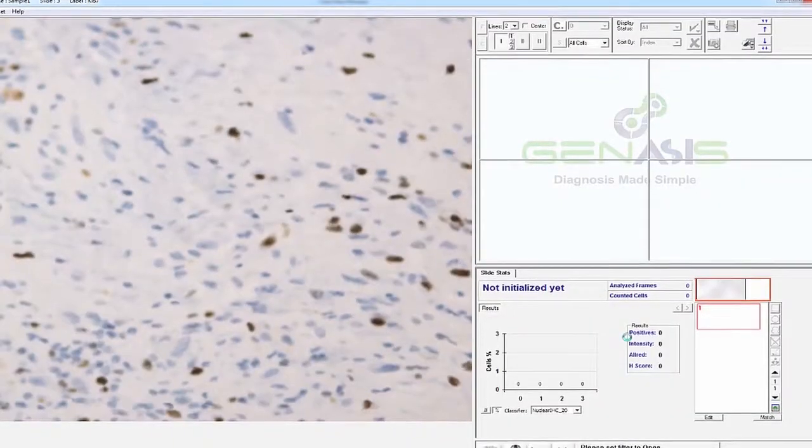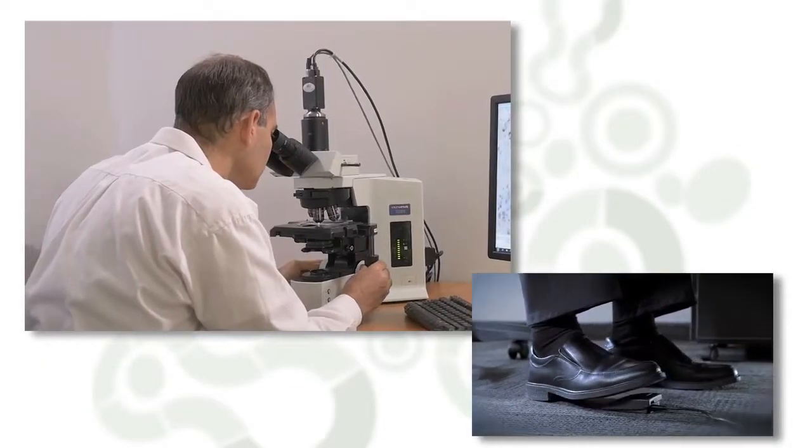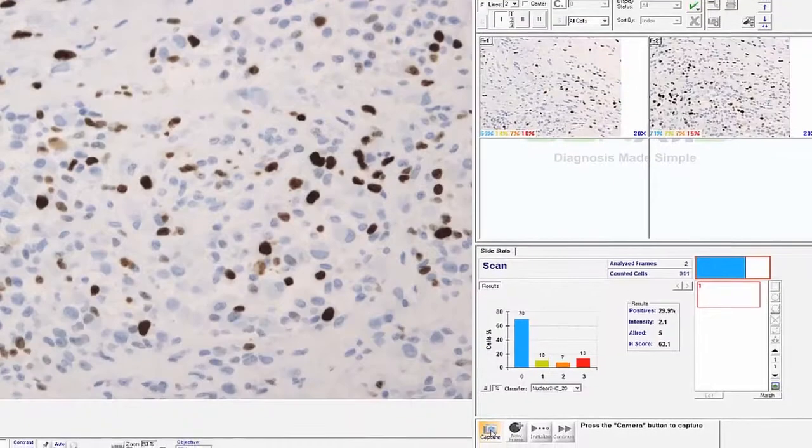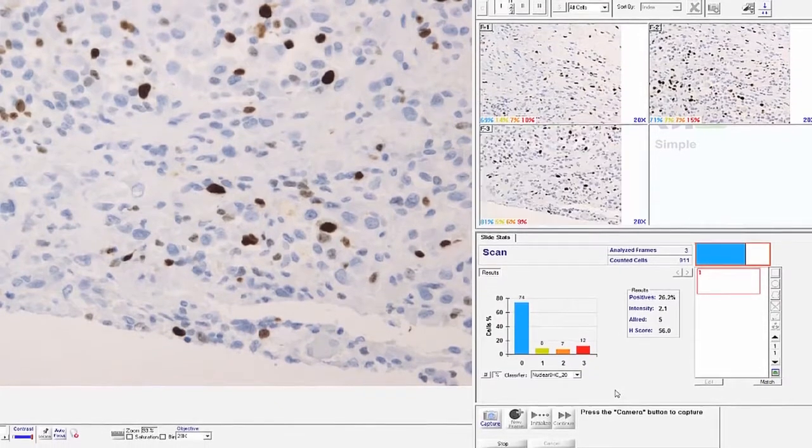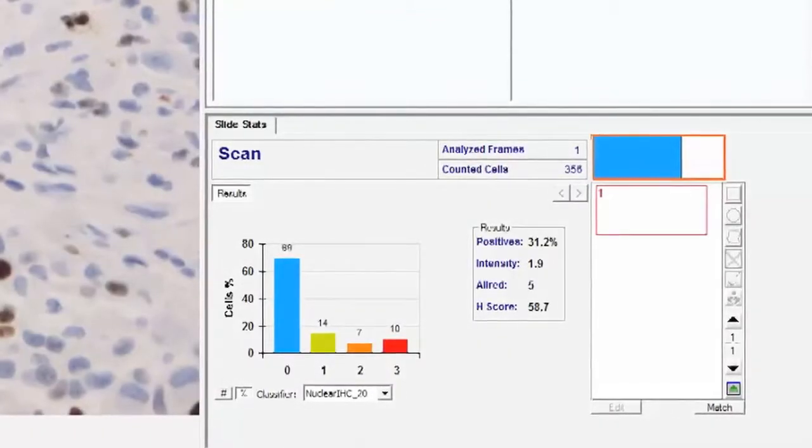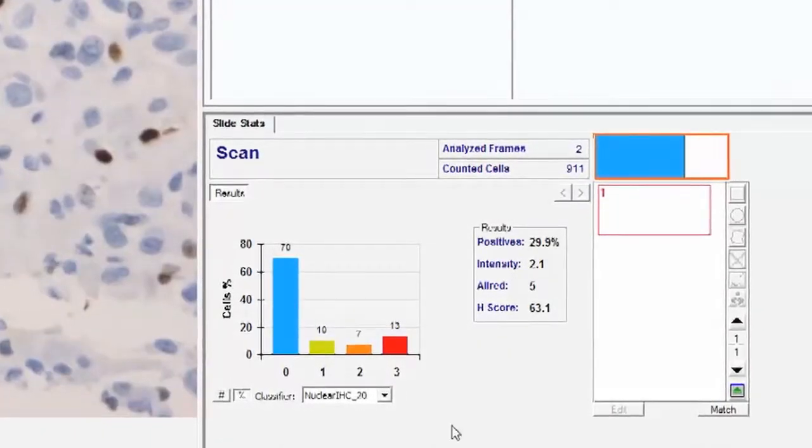Relevant tumor regions are then captured using a high-resolution camera and analyzed in real-time. HiPath segments and classifies all tumor cells using ASI's advanced image analysis algorithms. Quantitative scores and statistics are displayed in real-time.